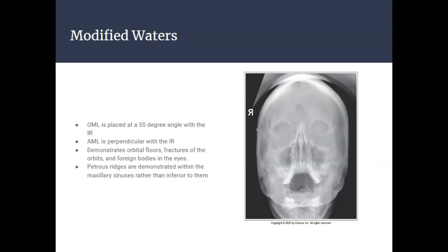I also quickly wanted to go over the modified Waters view because it is performed in the clinic setting. So the difference is, and this is an open mouth, but mostly you will do a closed mouth. Very seldom have I seen anybody do an open mouth for the sphenoid sinuses. But it is important to know that you would do the open mouth for the sphenoid. But let's get back to the modified Waters.